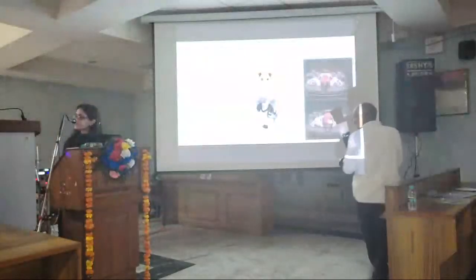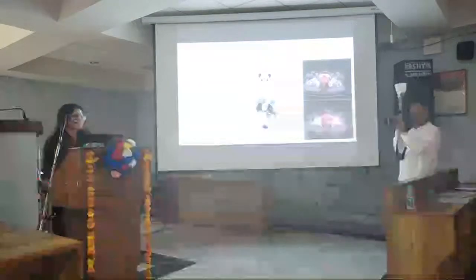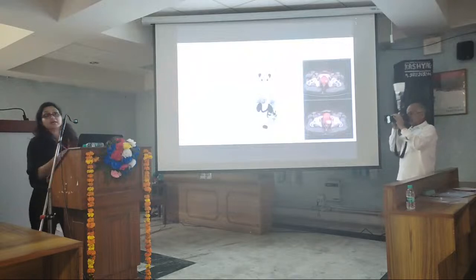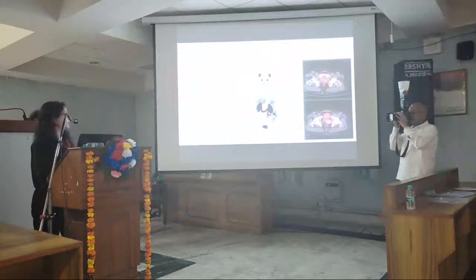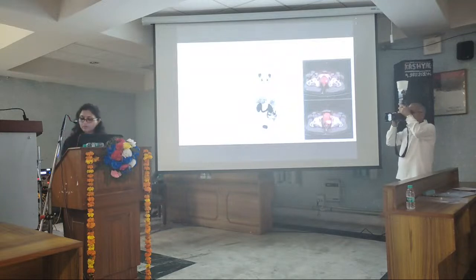So coming to the next topic, sir, if after PSMA PET-CT the patient is clinically localized, how do we proceed with the treatment? Like in this example, a 76-year-old male, initially PIRADS 5, but PSA was very high. This is the beauty of PSMA PET-CT. Still, it was localized disease, though locally advanced. So in this kind of patient, how do we proceed, sir?